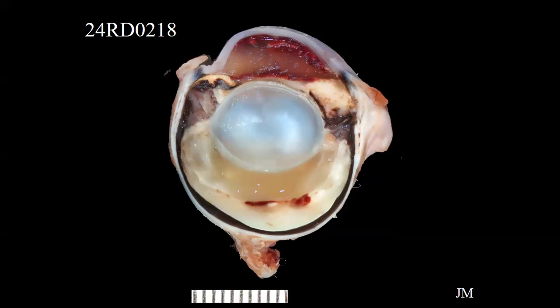All right. Next up is a 4-year-old male neutered domestic short-haired cat. This is the left eye. They report moderate blepharospasm, negative menace and dazzle, but positive palpebral reflexes. There was a superficial corneal stromal ulcer with corneal edema, some aqueous cell and flare 2 to 3 plus. They describe a large fibrinohemorrhagic clot that nearly fills the entire anterior chamber. And they were able to see some fibrovascular membranes and synechia on the lens capsule. They also described complete vitreal hemorrhage. And this has been going on for about 2 months.